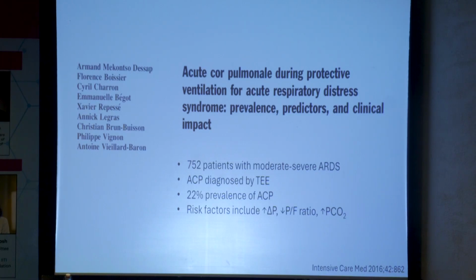Yeah, and at the same time, we will prepare the left IJ for a central line. Because now this patient is on multiple pressors and antibiotics, they need IV lines. So we cannot give all this stuff through the ECMO. So before I am prepping to dilate that IJ, I will put a left IJ for a central line.